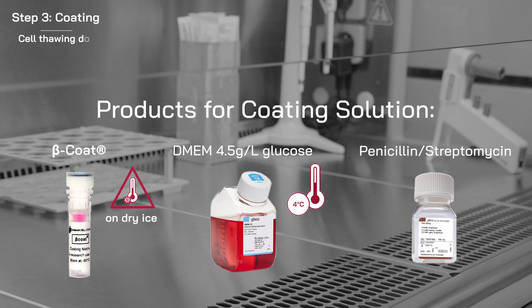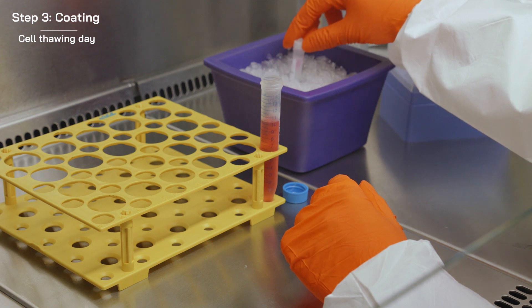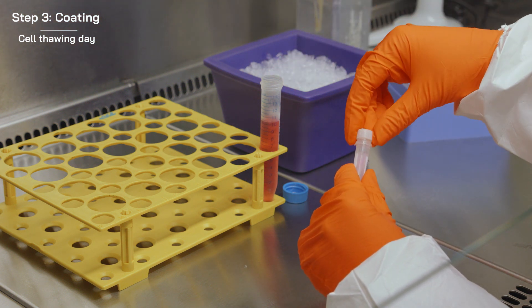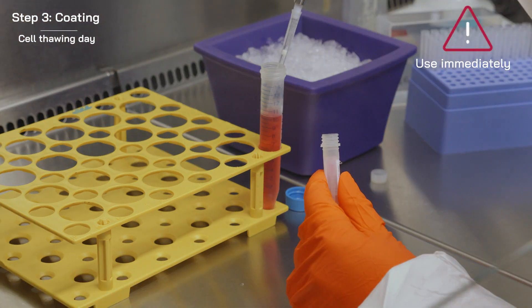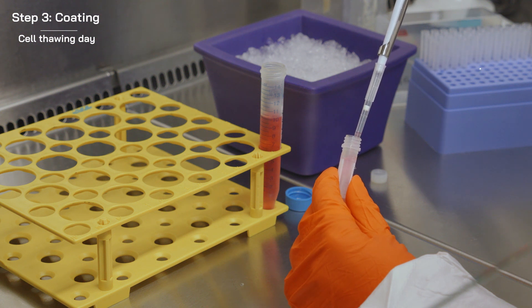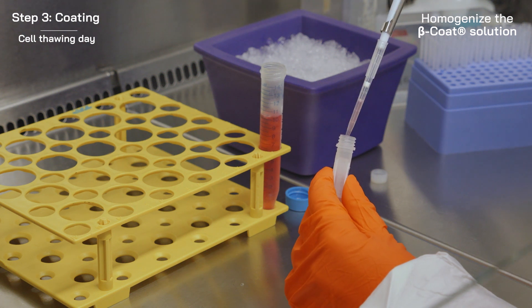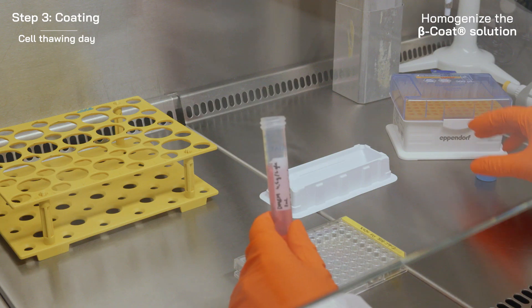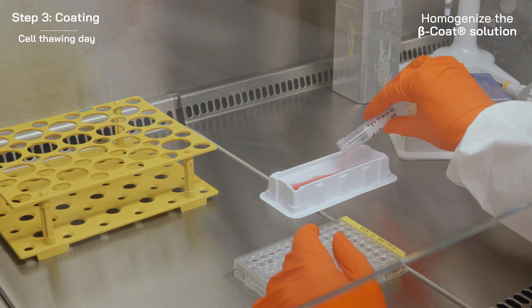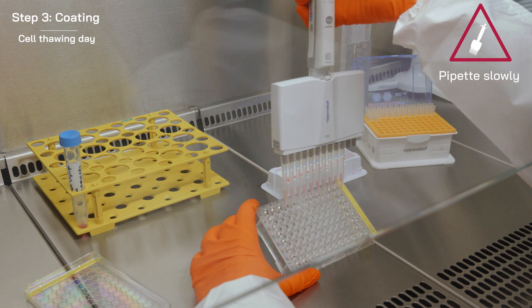Before starting, ensure all products and equipment are ready. Thaw the Beta Coating Reagent on ice and use it immediately to avoid polymerization. The Beta Coat should only be diluted with medium that has been pre-cooled to 4 degrees Celsius. Pipette the diluted Beta Coat slowly to avoid bubbles and polymerization.